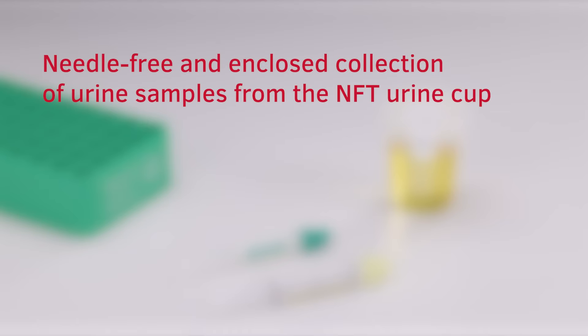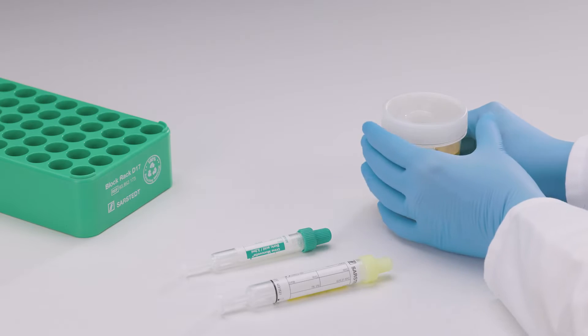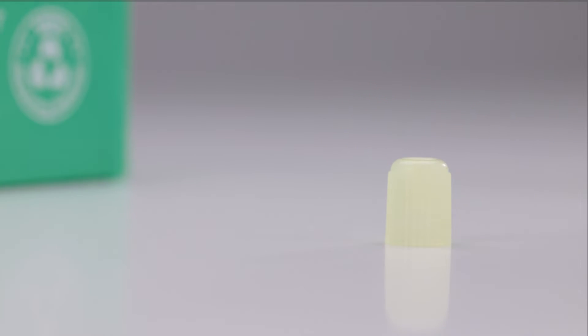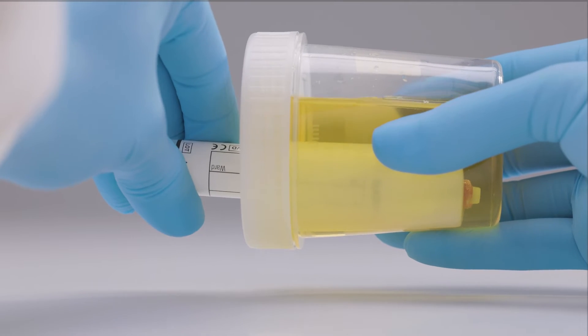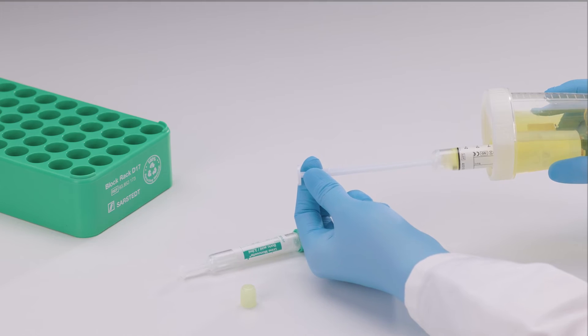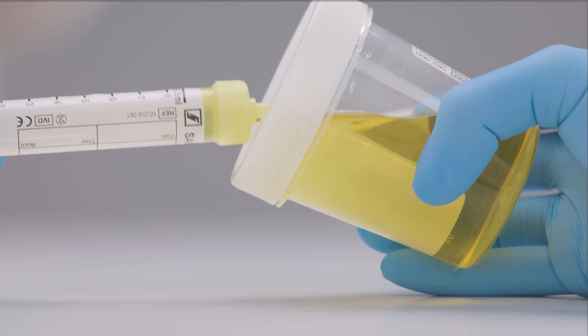Needle-free and enclosed collection of urine samples from the NFT urine cup. After receiving the sample in the NFT urine cup, peel off the safety label from the lid. Ensure that the NFT urine cup lid is tightly closed to prevent spillage. Remove the stopper from the tip of the urine MonoVet and set it aside. Place the NFT cup on its side and guide the tip of the urine MonoVet into the needle-free transfer unit, ensuring that the tip penetrates the NFT membrane. Slowly pull the piston back towards the bottom of the urine MonoVet and wait until no more urine flows in. Detach the urine MonoVet from the NFT membrane.